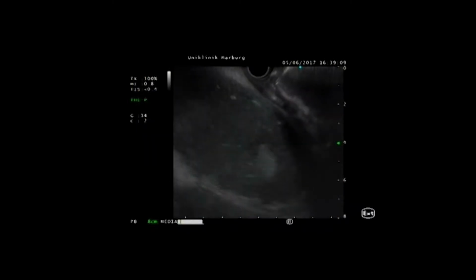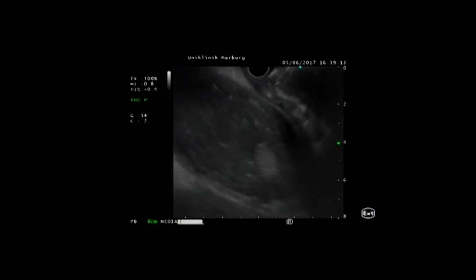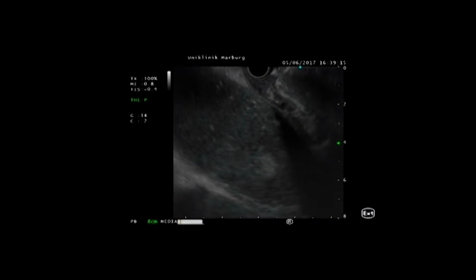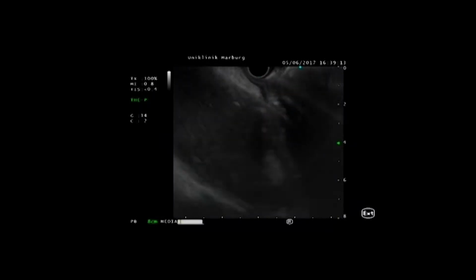The endoscopic ultrasound (EUS) image, seen from the antrum, shows a tightly filled gallbladder with hyperechoic reflexes in a 71-year-old patient. The patient had an inoperable carcinoma of the pancreatic head, with tumor compression of the cystic duct. Diversion of the biliary tract had previously been carried out by placing two stents in the common hepatic duct (CHD).